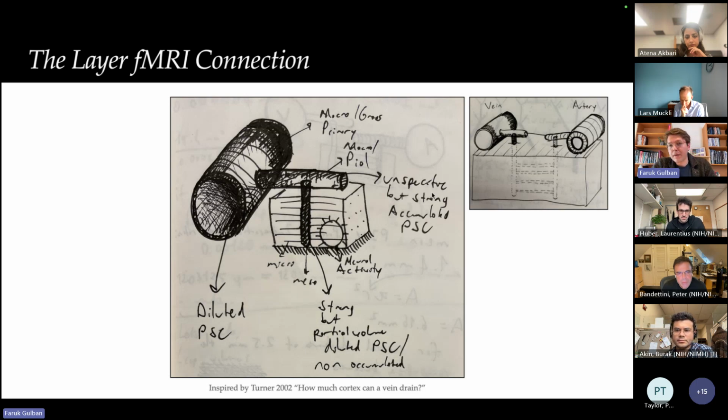And maybe if there's a big area, you might even see a higher percent signal change in the pial veins because they are pooling all the area together and giving us a stronger oxygenated versus deoxygenated comparison signal. But of course, it doesn't always go high. It doesn't mean that the more you look at a larger vein, the more percent signal change you will see. No, because when you go to really large veins that are basically draining from all the other areas of the brain that are maybe not active, your signal now becomes diluted and percent signal change goes down. I mean, this is the story given by Bob Turner, basically.